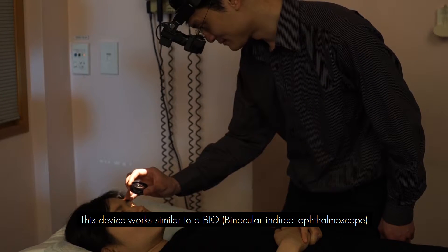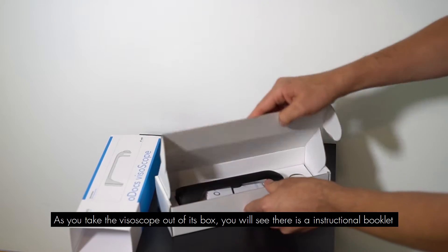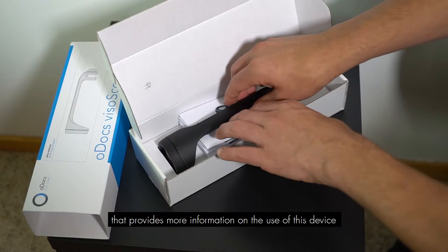This device works similar to a BIO. As you take the visoScope out of the box, you will see there is an instruction booklet that provides more information on the use of this device.